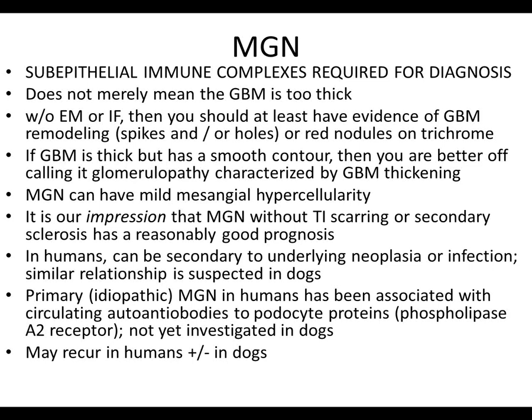Remember, I think I told you last month that the mesangial cells will proliferate with very little stimulation. They just like to proliferate. That's what they do. So just having mesangial hypercellularity is okay. It still can be something that happens with membranous disease.